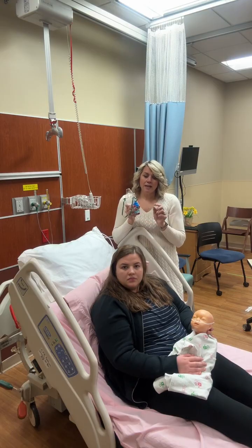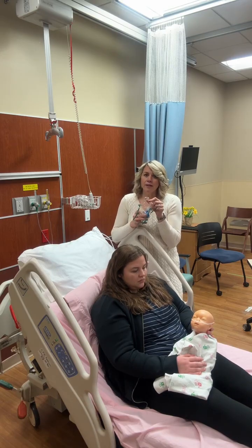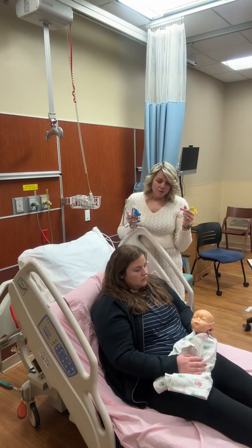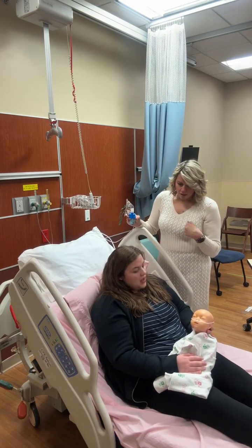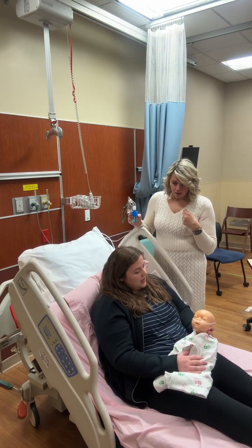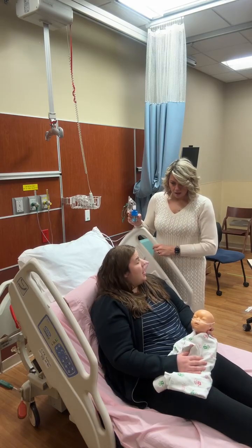So I'm going to ask Ashley some questions about her baby, and that's going to help me determine if a mask is appropriate to put on this infant. So Ashley, can you tell me what's been going on with the baby? Yeah, she's been coughing and really phlegmy, and she's been vomiting.